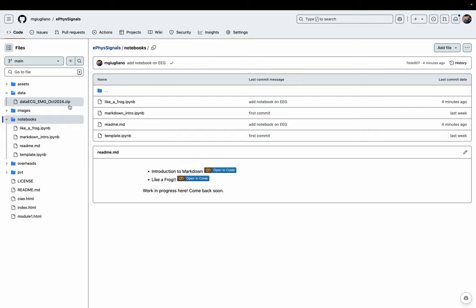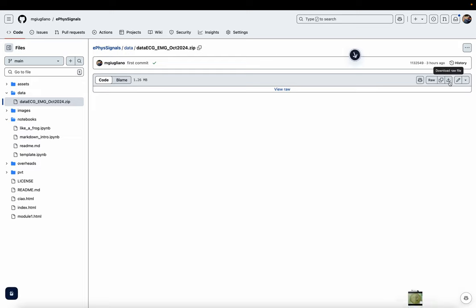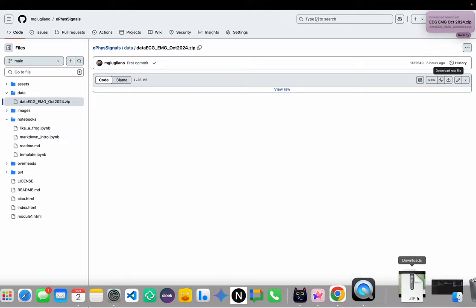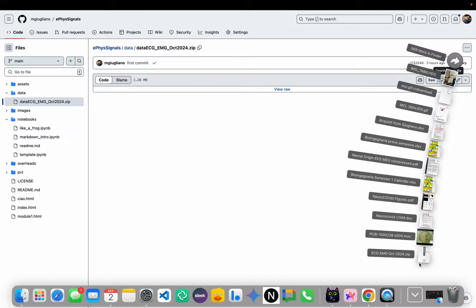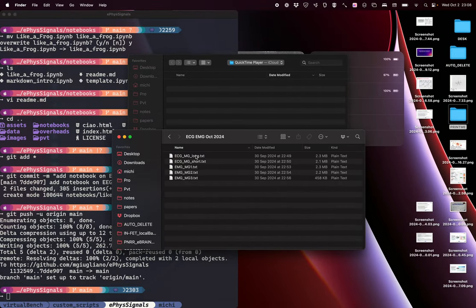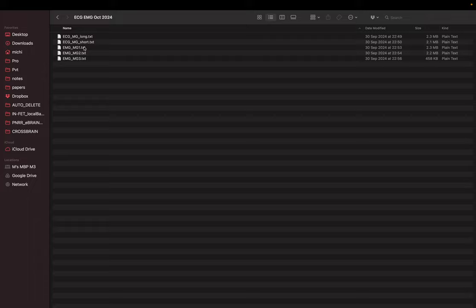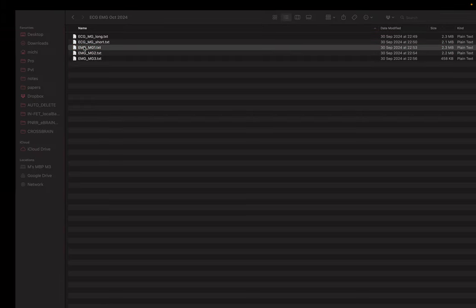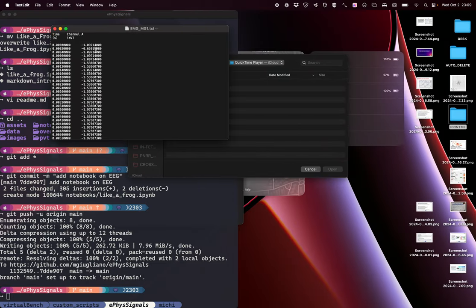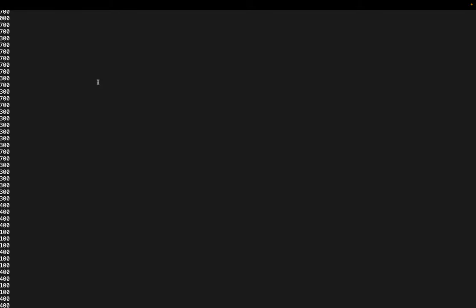You could be maybe brave and download it on your computer, just simply clicking here and then clicking on this download raw file button. If I click it, it will be downloaded to my computer. Maybe I can unzip it and I will be able to see this folder here. This folder contains text files.